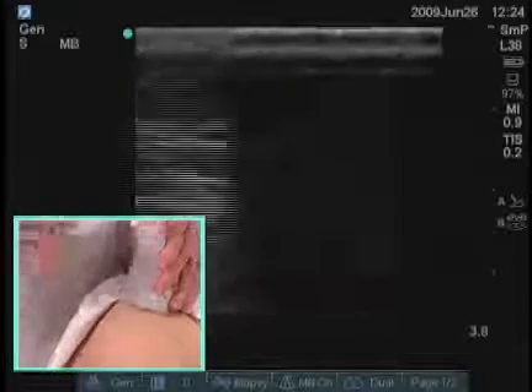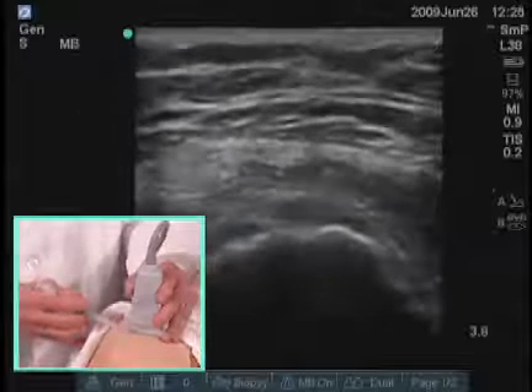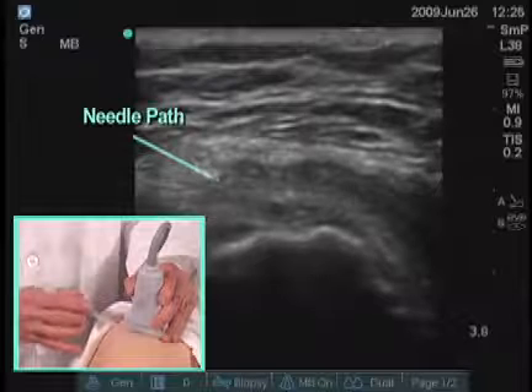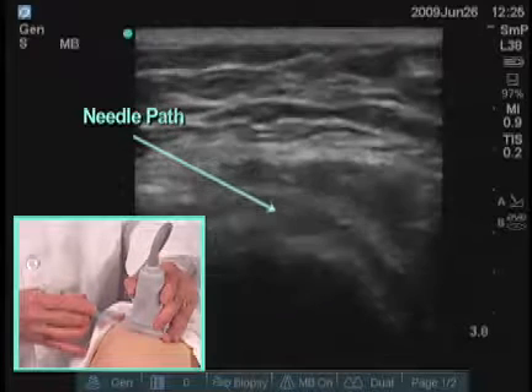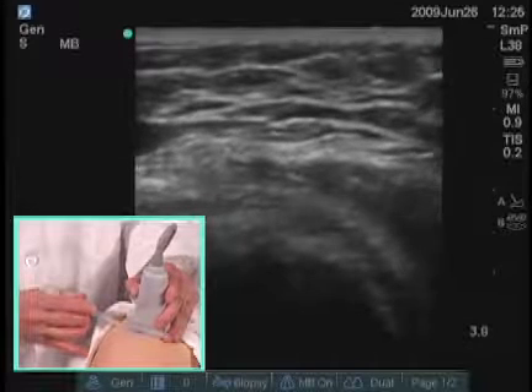This can also be injected in a transverse plane this way. Sometimes it's easier to have the alignment going in the same direction as you're looking. So I'm looking across the patient at the ultrasound screen, and I now have my transducer pointing in that direction.